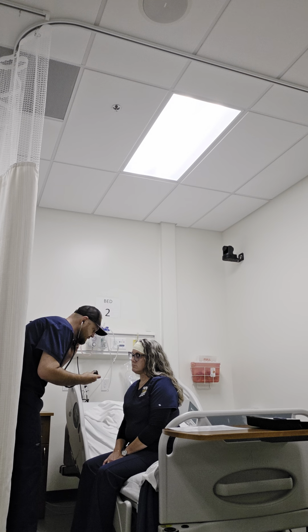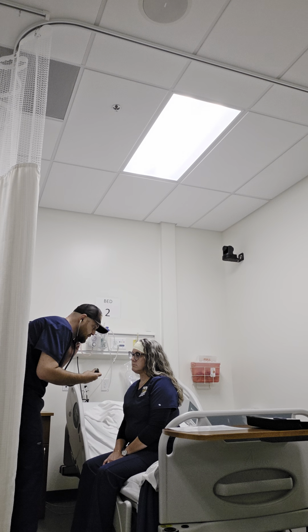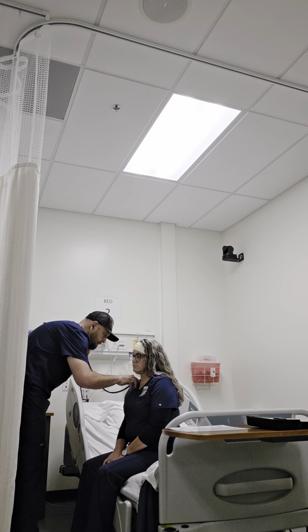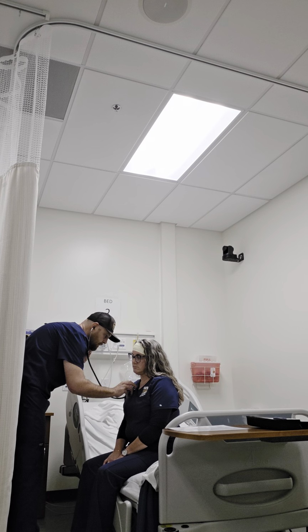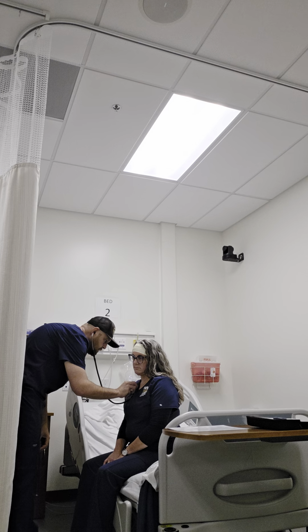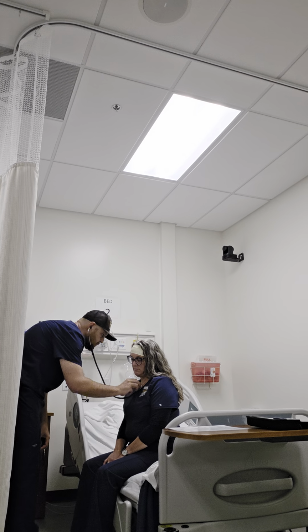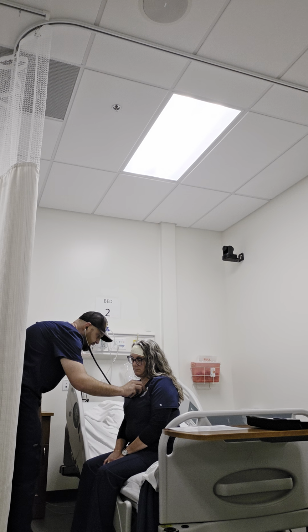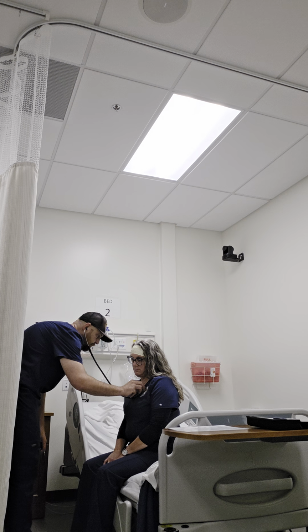First assessment is the aortic valve, which is second intercostal space, right sternal side. Next, we're going to move to the second intercostal space, left sternal side, the pulmonic valve.